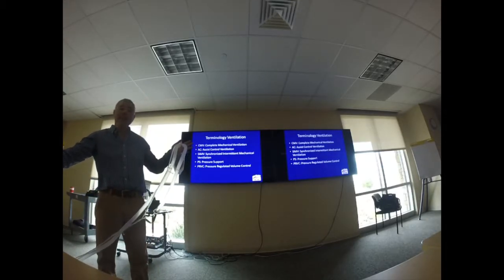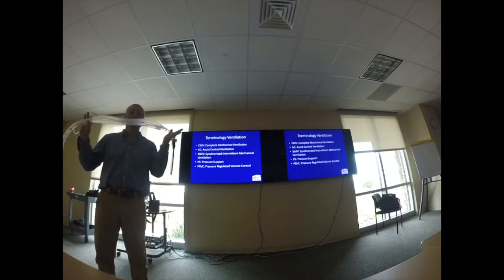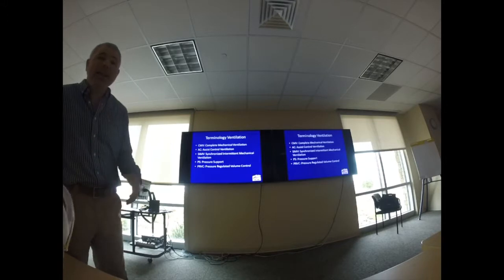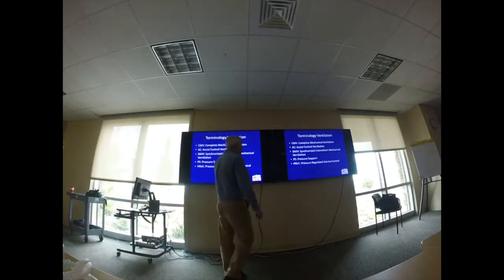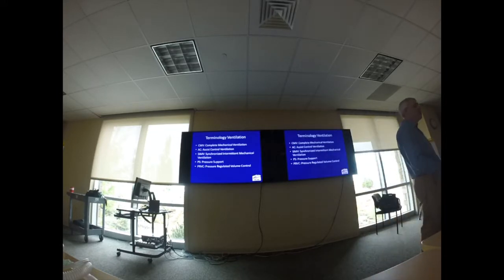So I'm going to give at least 10 of pressure support. So any patient on SIMV, I'd put them on 10 of pressure support so they don't have to fight the whole circuit. Does that make sense to you guys? So that way if they want to take 300, they can get 300. Or they want to take 250, they can take 250 without having to fight the entire circuit, right? If you're not giving them any pressure support on SIMV, you're increasing the chance of them tiring out and wearing down and having to fight that ventilator to take those extra efforts that they want to have.